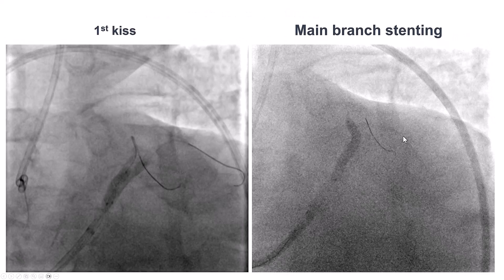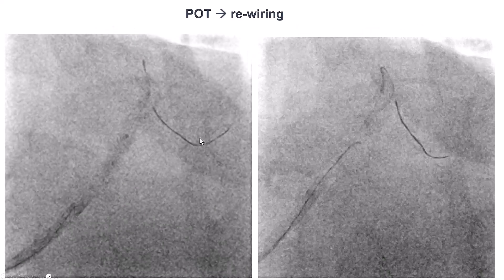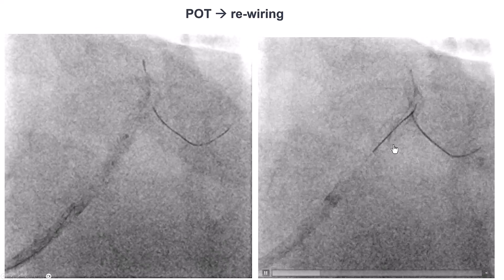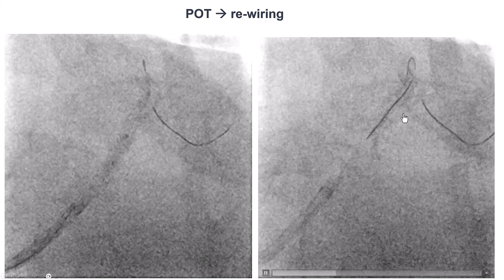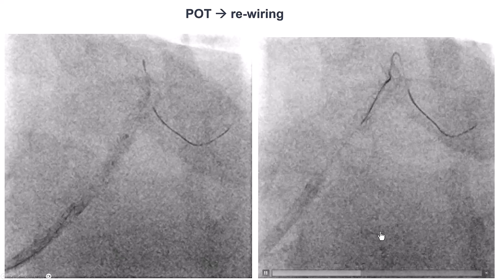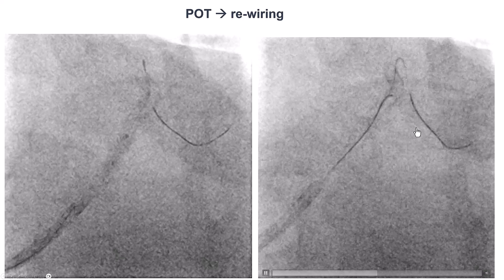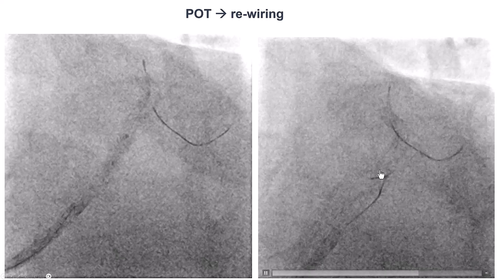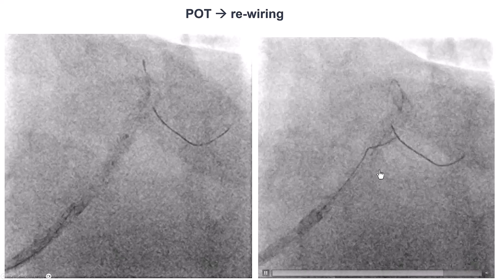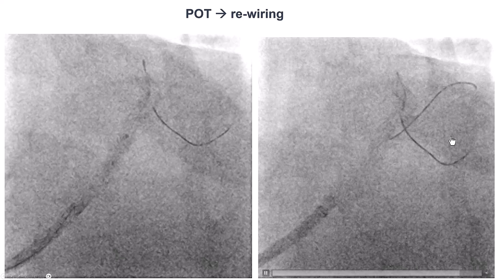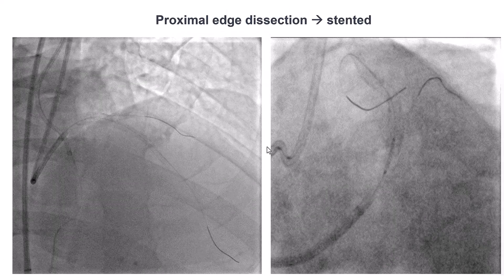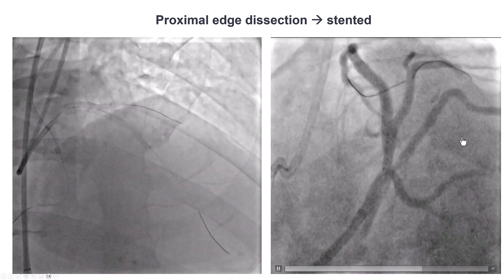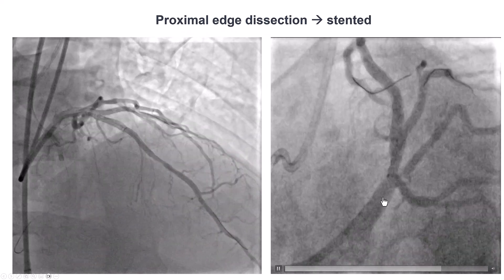We rewired for the first kissing balloon inflation, deployed the stent in the main vessel, performed the proximal optimization technique, then rewired the diagonal branch — which was not too hard even with a workhorse guidewire despite the angulation. After rewiring, we performed the second kissing balloon inflation, then final proximal optimization technique. There was some area of dissection proximal to the stent, so we covered that with an additional drug-eluting stent.